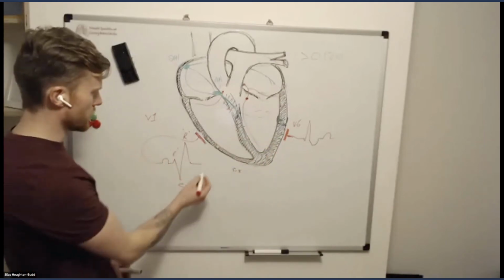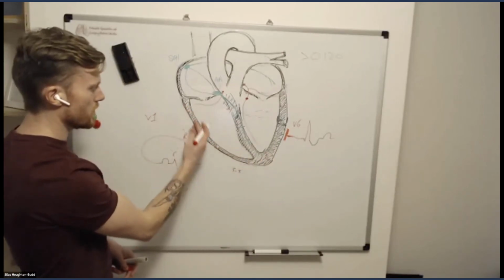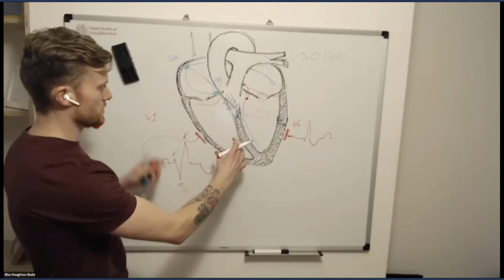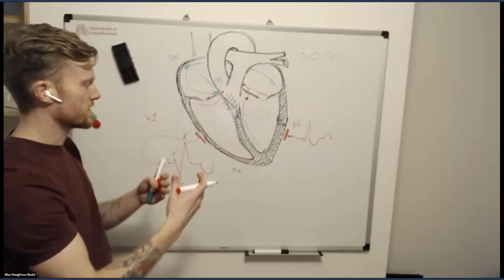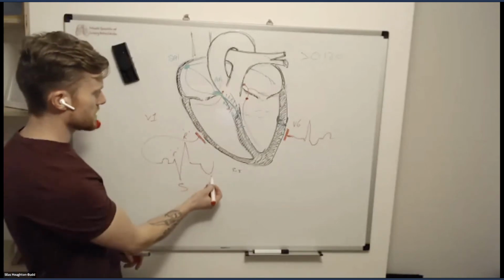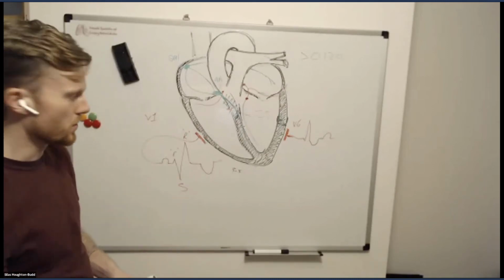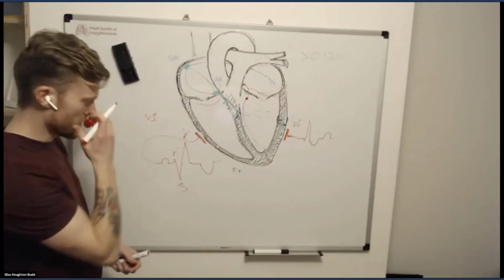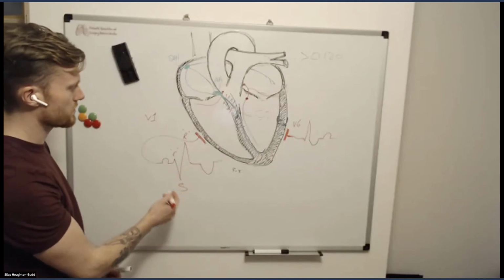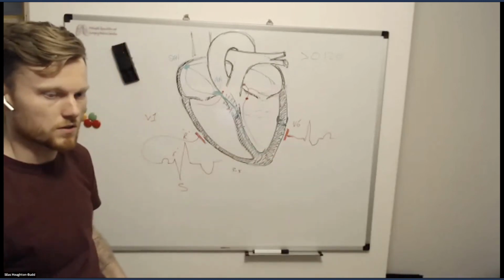What's normal in a right bundle branch block, though, is that in the right ventricle, where this depolarization vector is abnormal, we should see a repolarization vector that is also abnormal, because the order in which the cells have contracted, and therefore are repolarizing again, is abnormal. And so a discordant T wave is expected in the anterior leads in a right bundle branch block. So what we get, and we'll look at some ECGs shortly, is a small r, s, R with a discordant or negative T wave in V1, and then a deep slurred S wave in V6 as diagnostic factors for right bundle branch block.